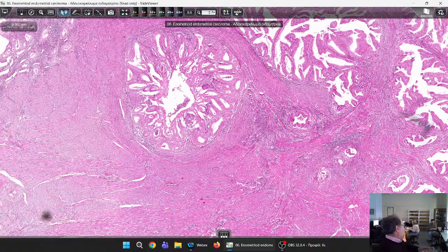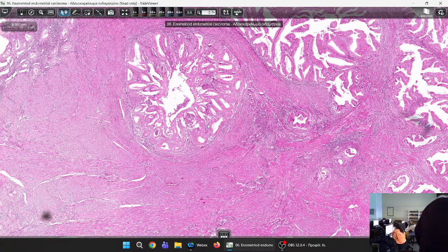That means hormone dependent, because as far as endometrial cancer is concerned, you have to see if it is hormone dependent or hormone independent. If it is hormone dependent, as the case here, you have the endometrioid type, which can be of low grade, intermediate grade, and high grade. It depends on how much of the tumor is occupied by a solid non-squamous component. This is the criterion to grade endometrioid carcinoma.